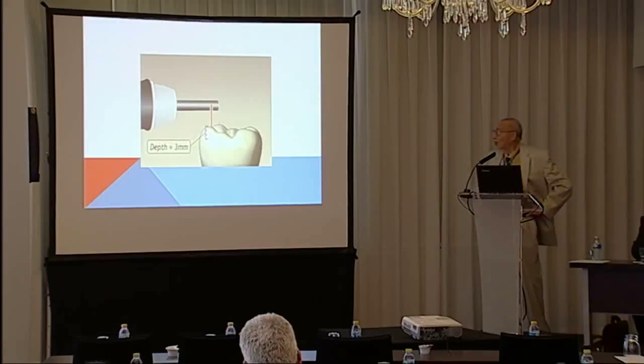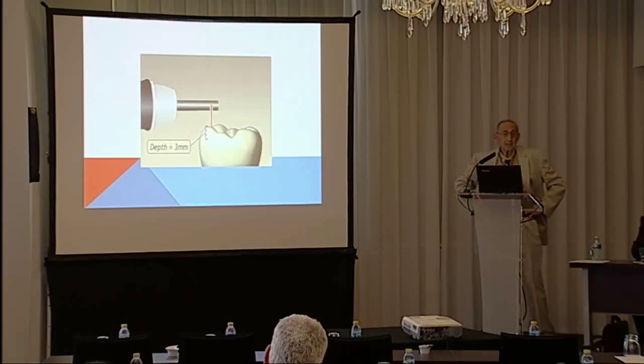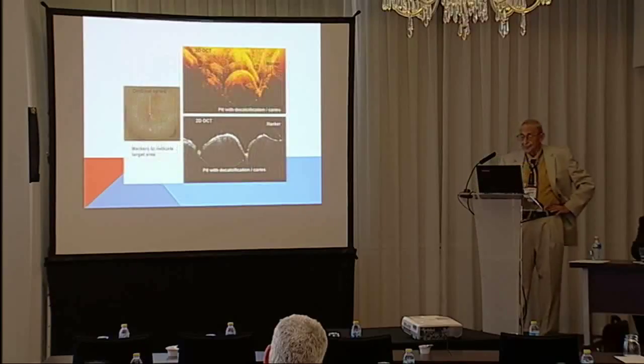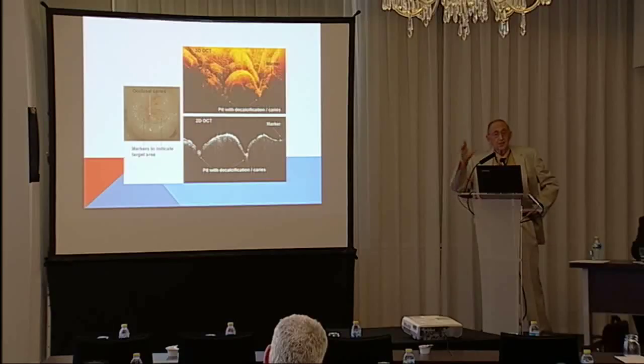This is the probe that is used right now. This is not adequate for going in the mouth. We have to design something. We've got some ideas that we would like to use, and it's just a question of getting enough funding to go ahead. All of this, what you're seeing now, is extracted teeth that are in blocks, and they're on the bench top.